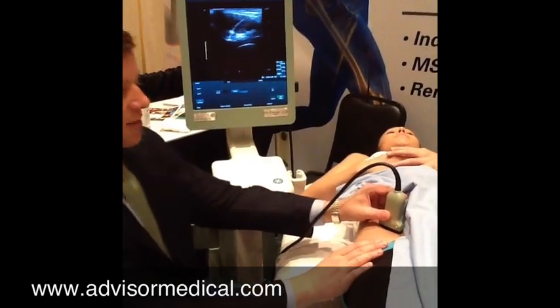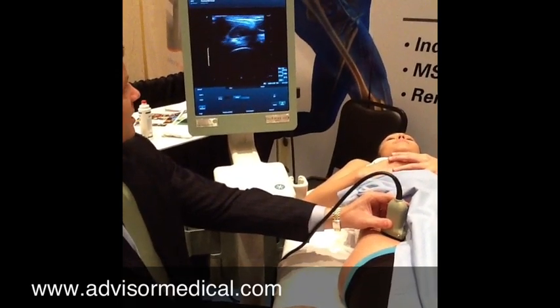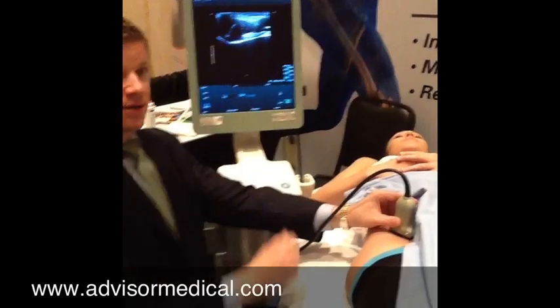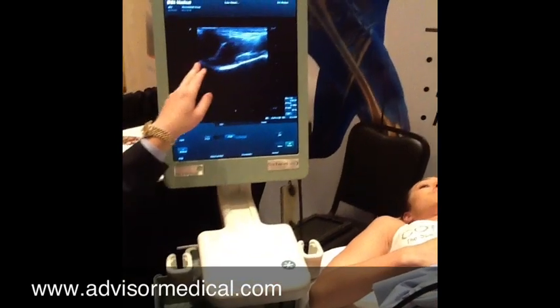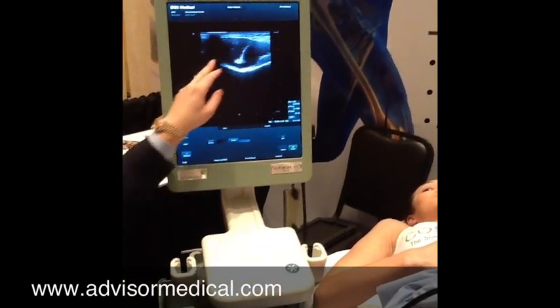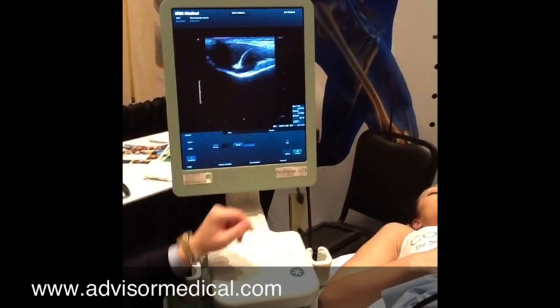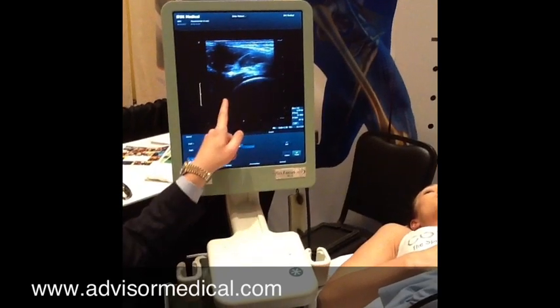Now because the trochanter is down here, what I want to do is slide my probe down a little bit. If you focus on the screen here, you're going to see the pelvic line — there's a little dip here. Position this in the center of the screen where the dip is and then drop it down. The femoral head will always come into view here.